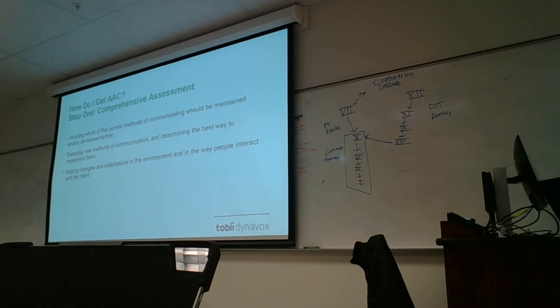Another thing to consider: sometimes with Medicaid or some insurance companies, you can submit everything, and once they see the information, even the evaluation report, they'll say, before we can approve this, you need to do a 30-day trial. Then Tobii Dynavox works with the insurance company or Medicaid to set up a trial where the client can trial the device for 30 days, and the SLP can gather more information and answer specific questions that these funding sources are looking for.